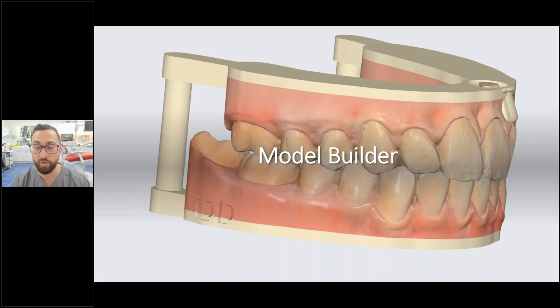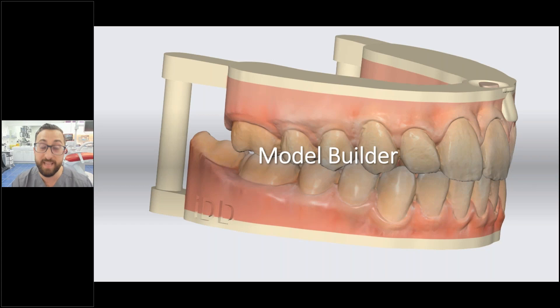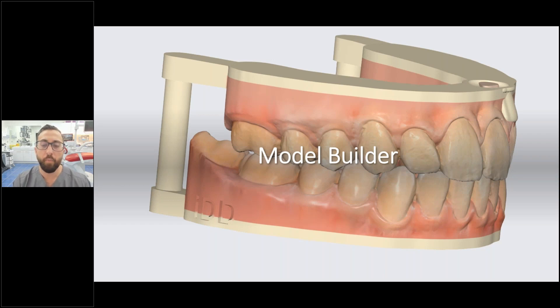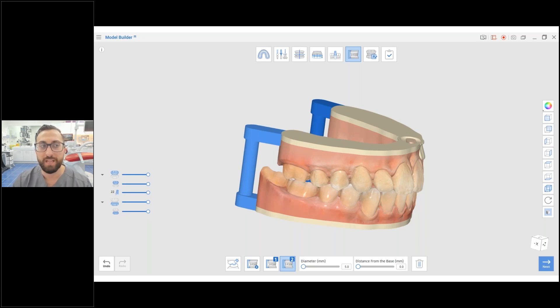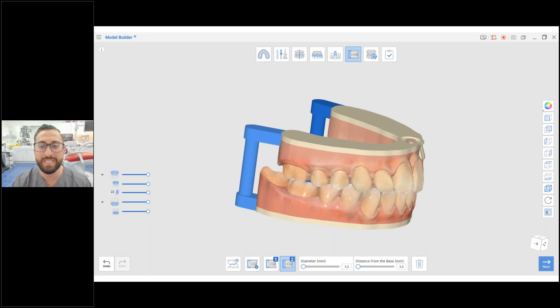Medit Model Builder is probably the best model builder on the entire market. 3Shape has a nice model builder, but it just doesn't have the same functionality. Previously we used MeshMixer, which was a very annoying process. Now with Medit Model Builder you can delegate this to your dental assistant — within a few clicks you can have a model ready for thermoform appliances, suck-downs, retainers, and orthodontic analysis.